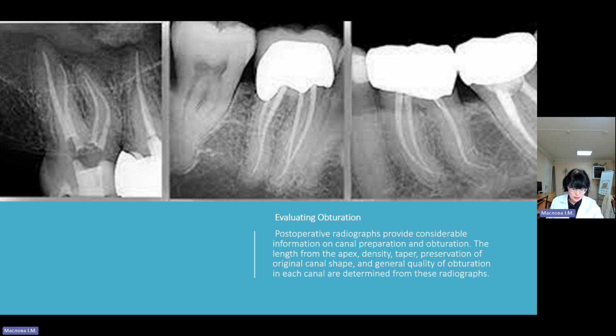A single radiograph is but a two-dimensional shadow of a three-dimensional object. For maximum information, the third dimension must be visualized and interpreted. The advent of 3D radiograph techniques such as CBCT, discussed later, has highlighted this concept.